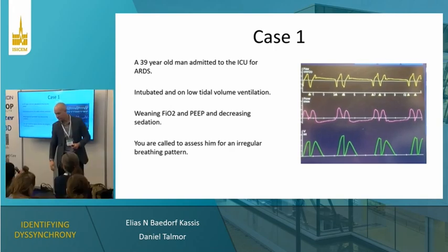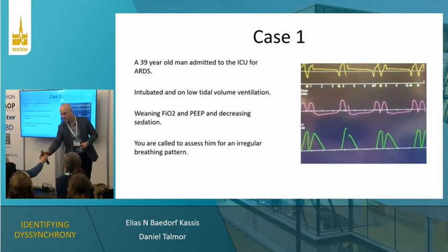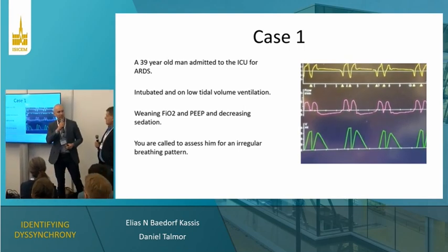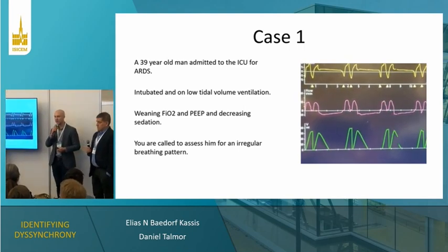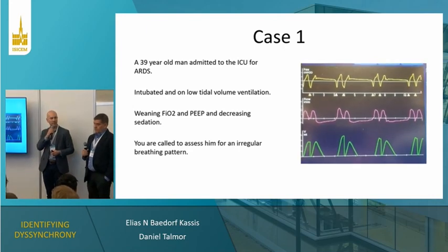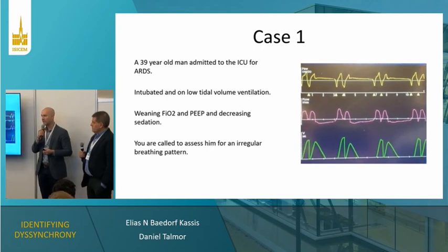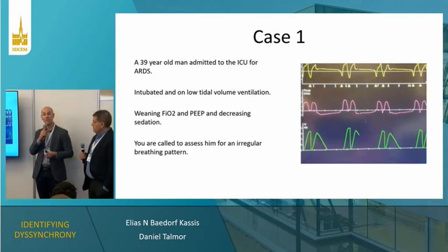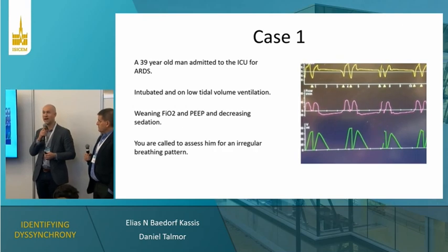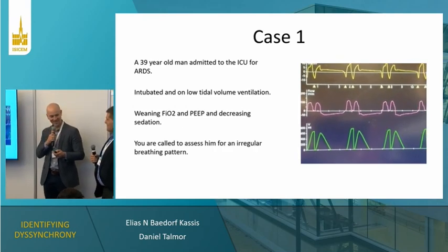So just wonder, why wasn't it flow starvation that he gets a too small tidal volume? Yeah, so there's a question about flow starvation, and we're going to be talking about that as well. There's a lot of overlap between patients who are having double triggering because this is one of the high drive forms of Dyssynchrony. And so flow asynchrony or flow starvation is common as well as other forms of high drive Dyssynchrony with this. And actually, you're beating us to the punch here a little bit, so very good job.